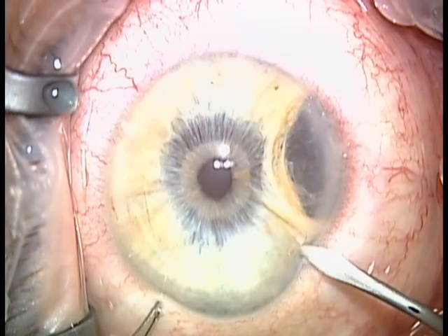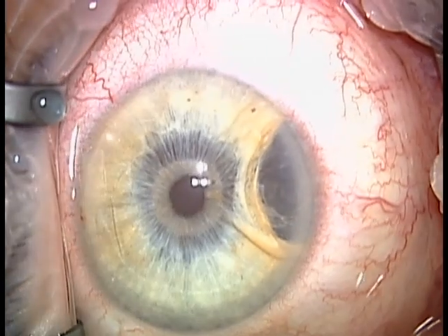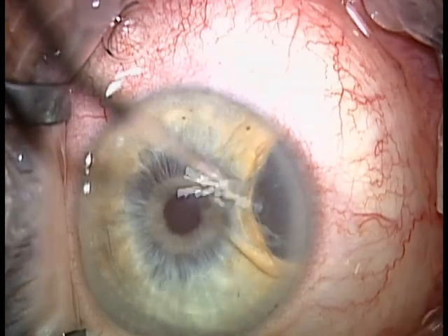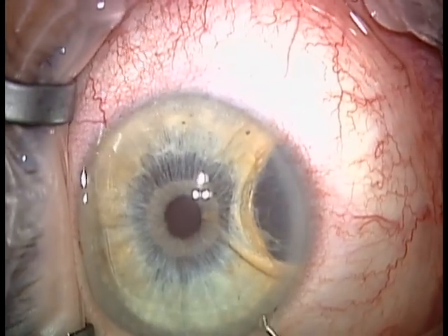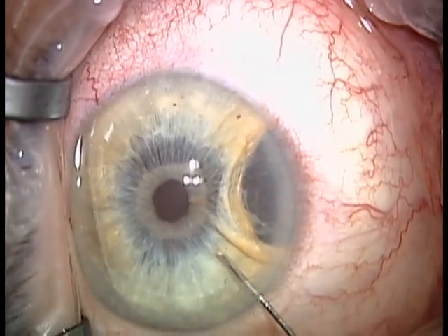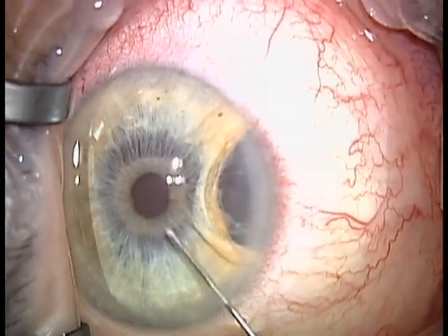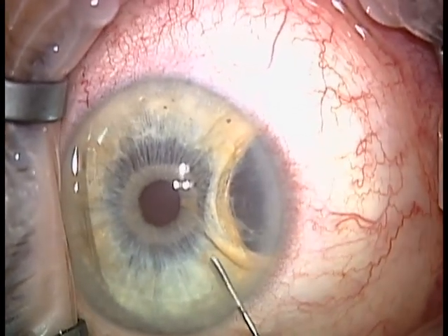The first step is to make paracenteses, irrigate the anterior chamber with 1% nonpreserved xylocaine, and then wall off the cyst both anteriorly and posteriorly to the iris with viscoelastic, so that in the event the cyst bursts or you have a leak, you can contain the alcohol.